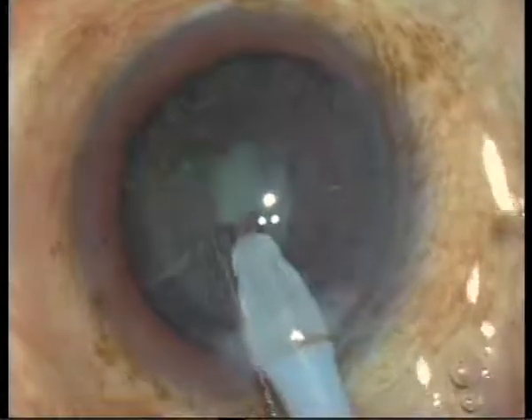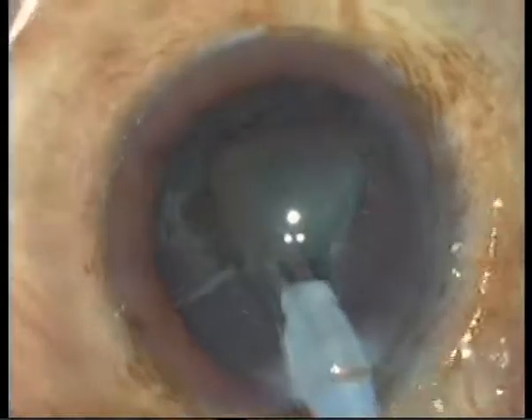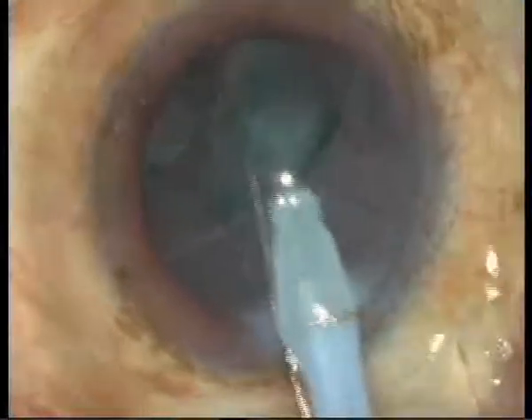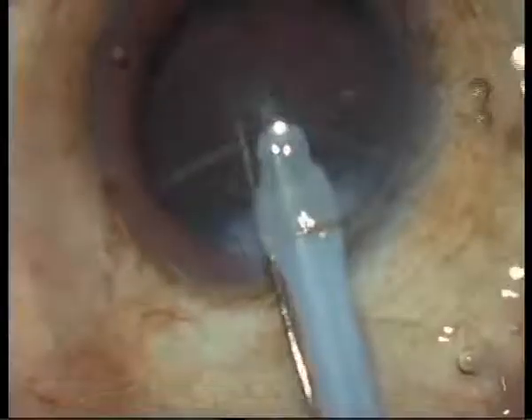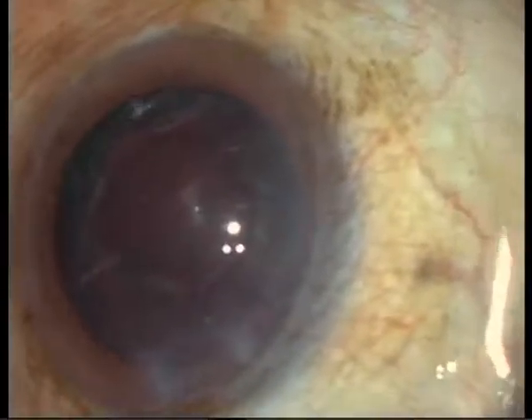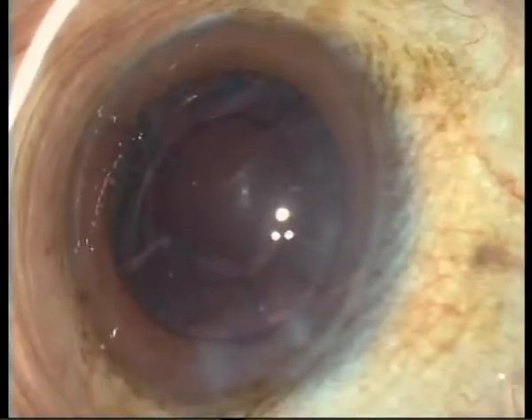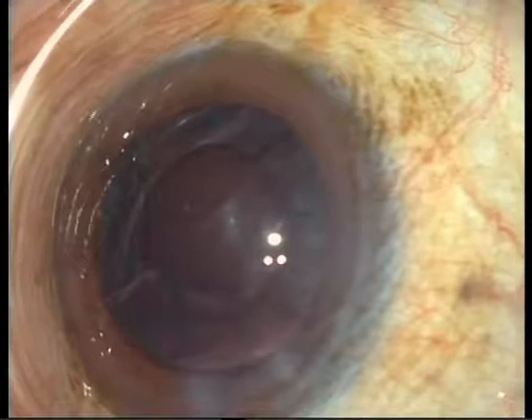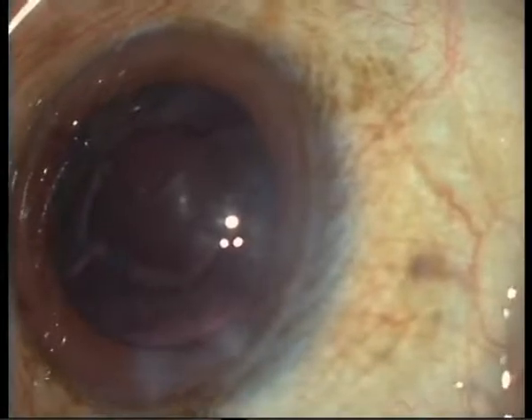I have to pay attention, because when you use another machine, you have to manage and see what the aspiration forces are. I think it is very important to have a sized and very well-centred anterior capsulorhexis, because this is important for the shrinkage and for the healing process of the capsular bag afterwards. Can you ask the patient to look again in the lights?